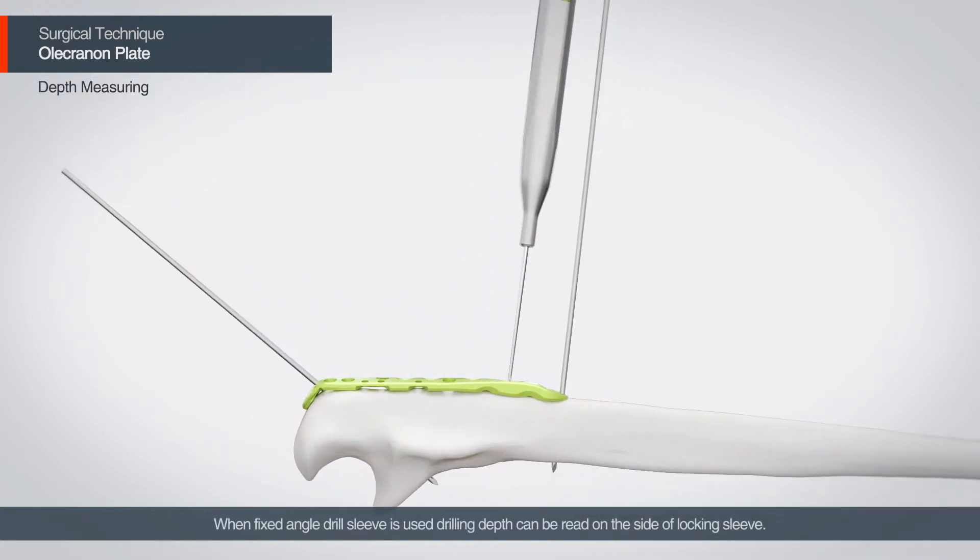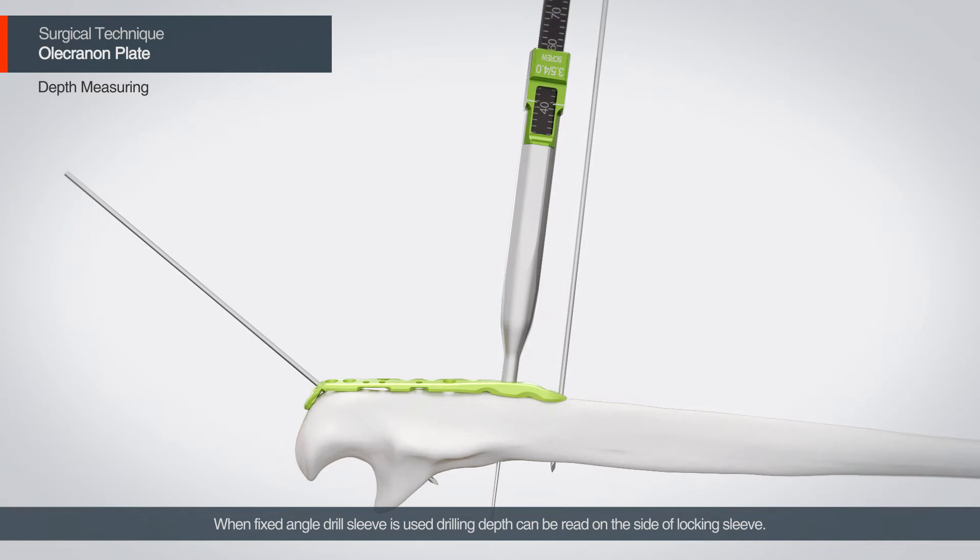When a fixed angle drill sleeve is used, drilling depth can be read on the side of the locking sleeve. A separate depth gauge is available for insufficient visibility of the locking sleeve.